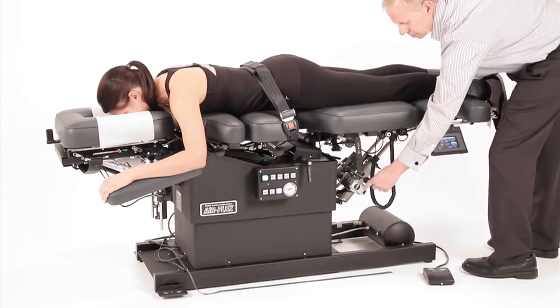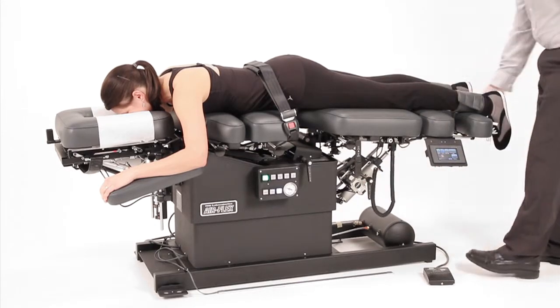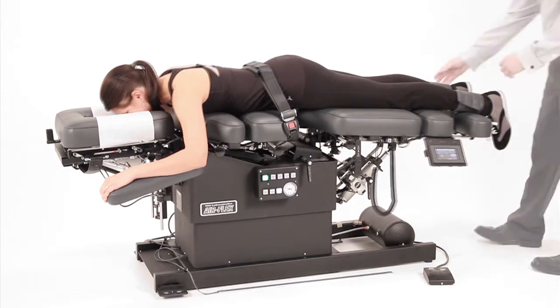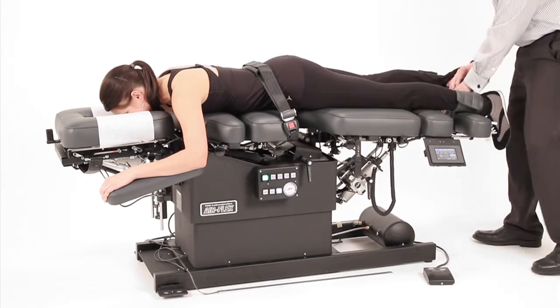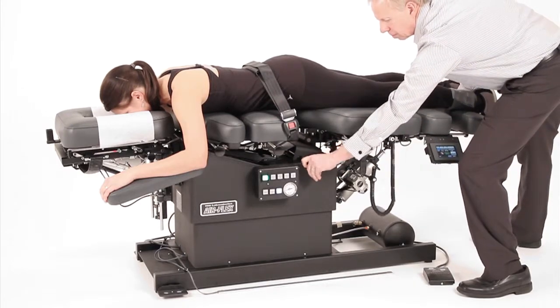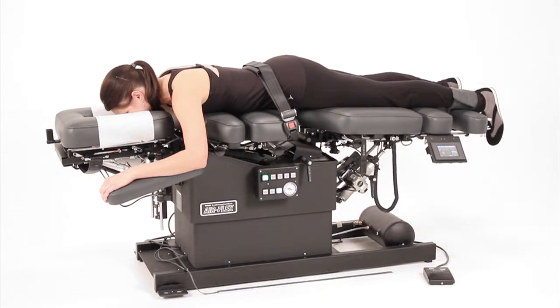During auto distraction, you may lock the patient in any flexed position. You can isolate one leg when treating sciatica by simply unstrapping one of your patient's ankles. Lateral positioning may also be used safely during automatic distraction.